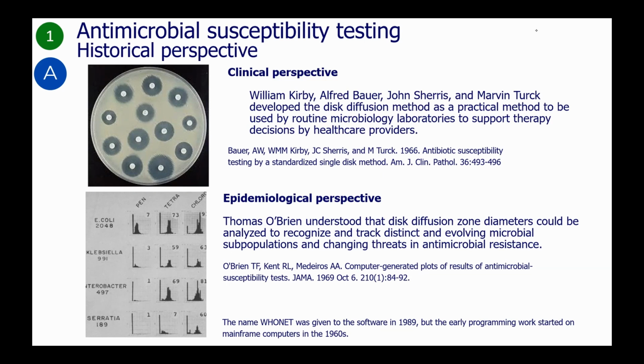The name WHONET was given to the software in 1989, but the early programming work led by Dr. O'Brien started on mainframe computers in the 1960s.